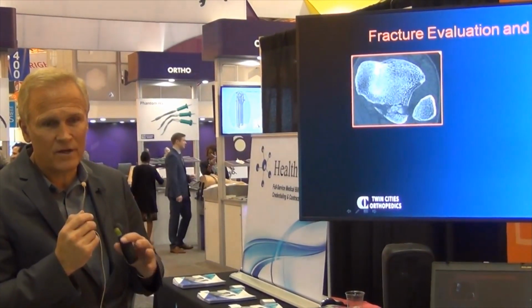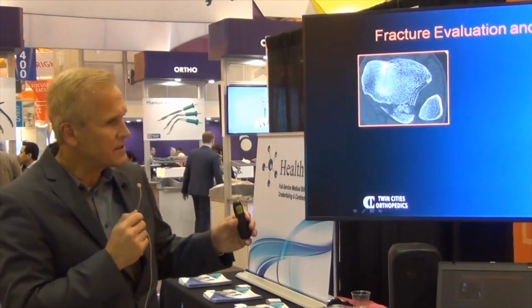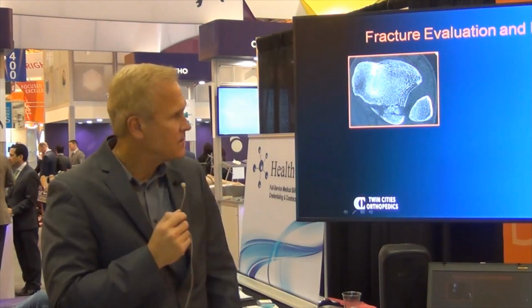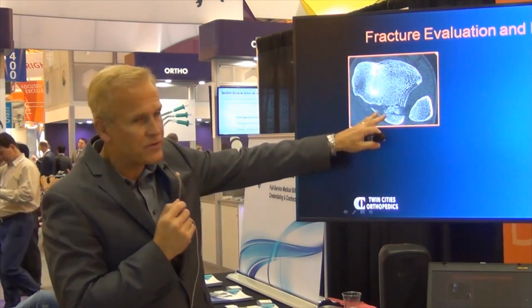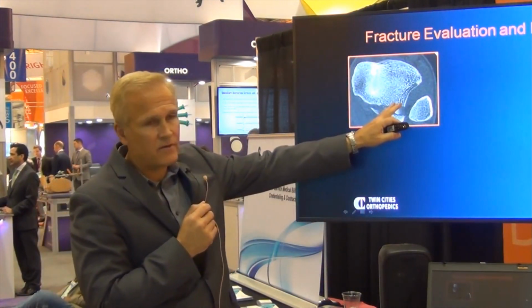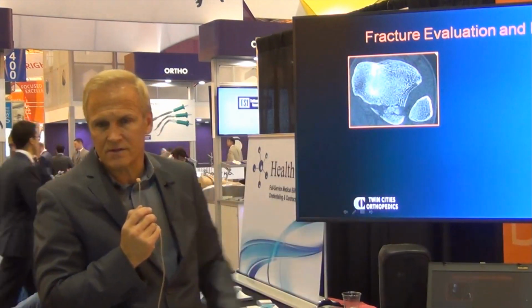Again, for fracture evaluation and healing, it's so easy now to get a better feel for these complex fractures, trimalleolar fractures with a lot of displacement. Do we have any fragments in between the major fragments that may prevent reduction? I get a really quick evaluation of where the syndesmosis is at.